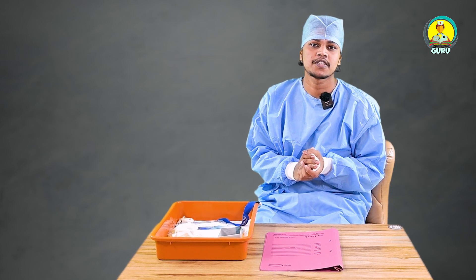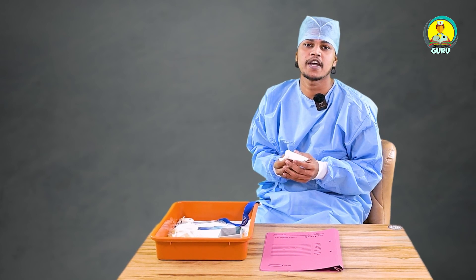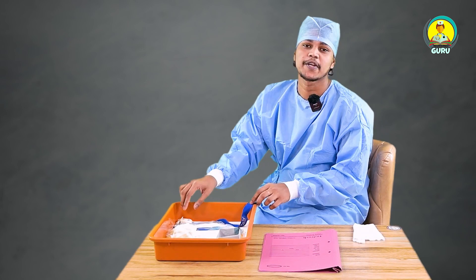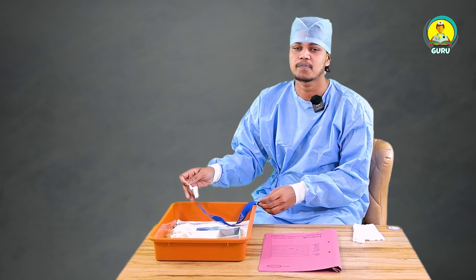So first of all, for every procedure we need hand washing. So wash your hands properly. The second step is we need to arrange all the things we need for blood collection.